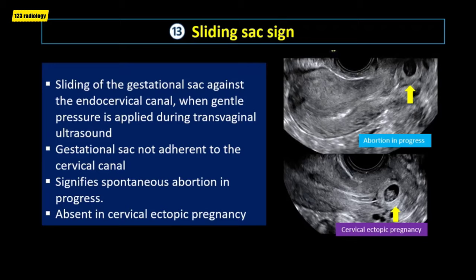The butterfly sign of choroid plexus refers to the normal appearance and shape of the choroid plexus on axial imaging of the fetal brain in the first trimester. This appearance confirms that there are two cerebral hemispheres. Absence of this sign may suggest holoprosencephaly.